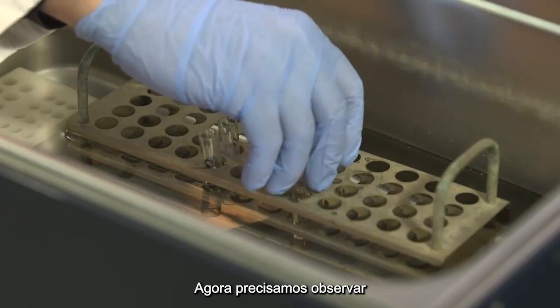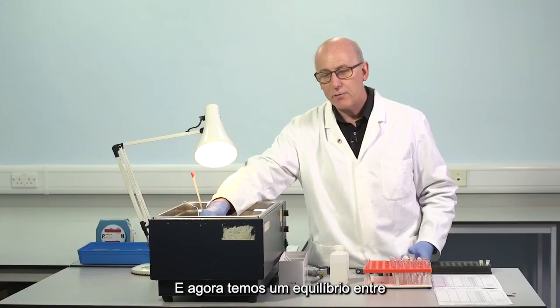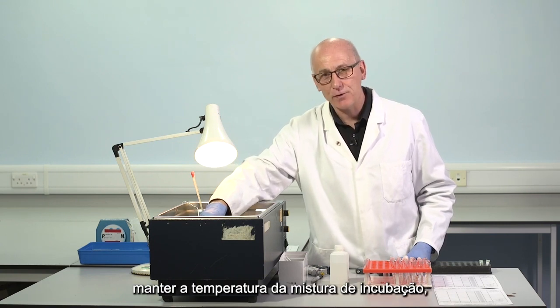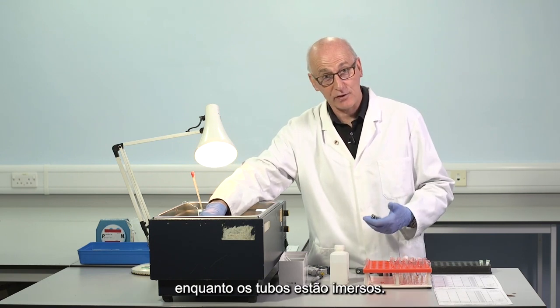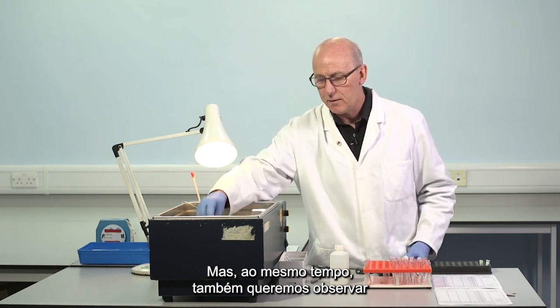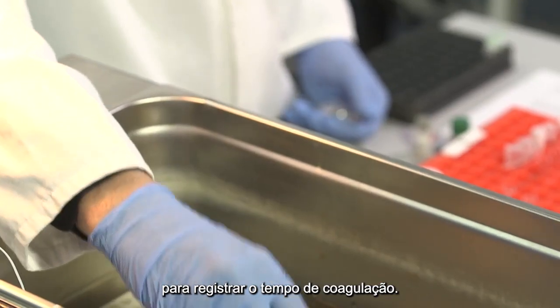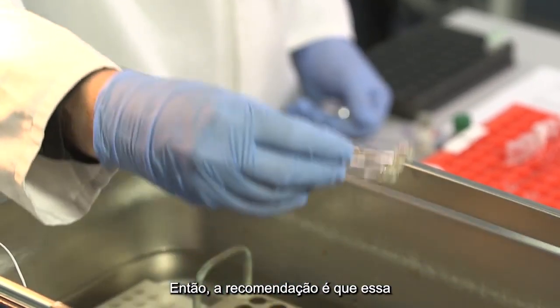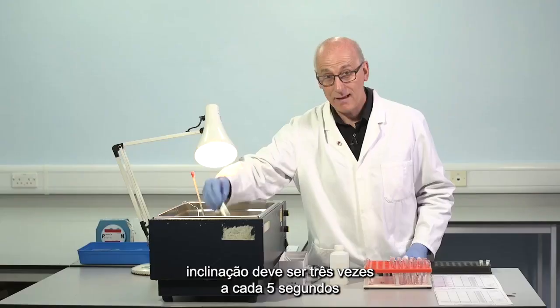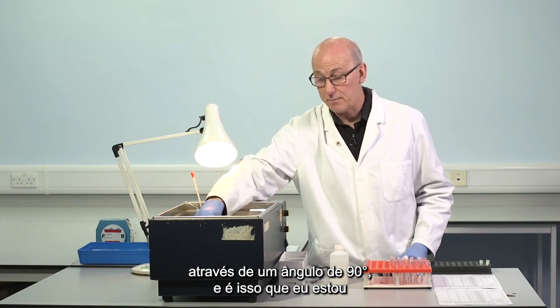Now we need to observe these mixtures for clot formation. So now we have a balance between maintaining the temperature of the incubation mix whilst the tubes are immersed, but at the same time we also want to observe in order to record the clotting time. So the recommendation is that this tilting should be 3 times every 5 seconds through an angle of 90 degrees. And that's what I'm now trying to do.